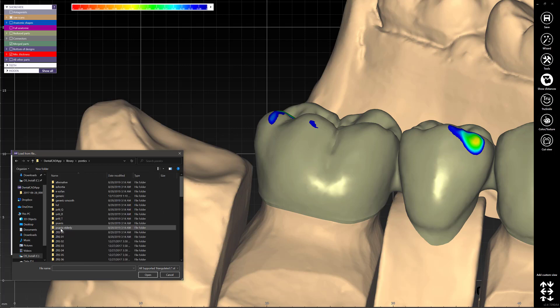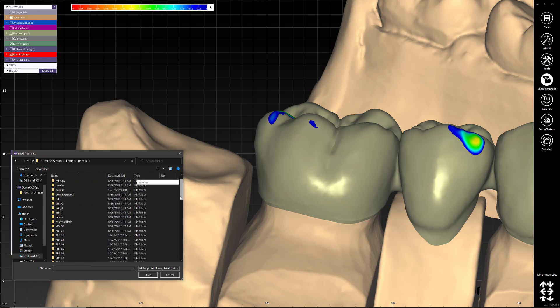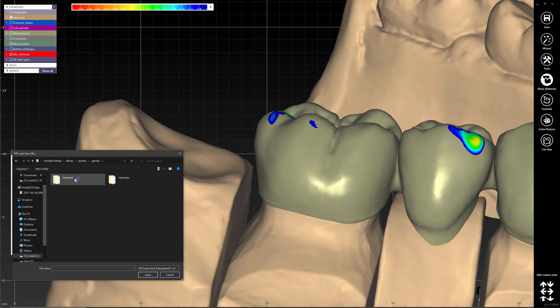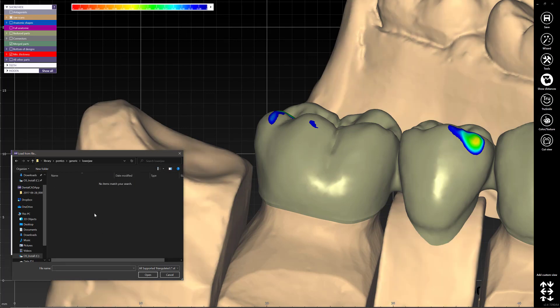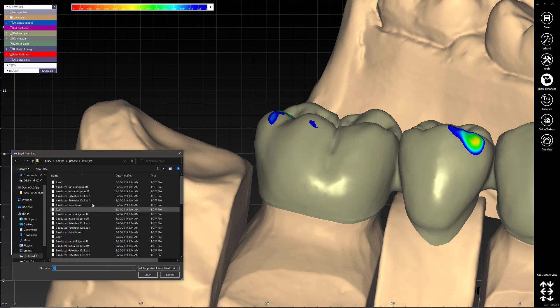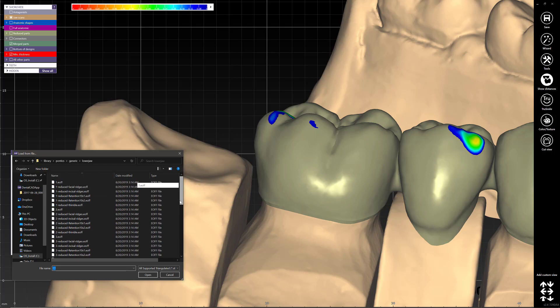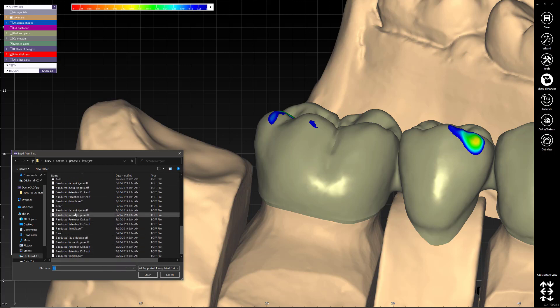Now you have all the libraries installed in exocad. This looks like the generic library for a lower jaw, so I won't see any SDLs to pull from. What I have to do is type asterisk-period-asterisk, press Enter, and then all the files available in this library will show up.